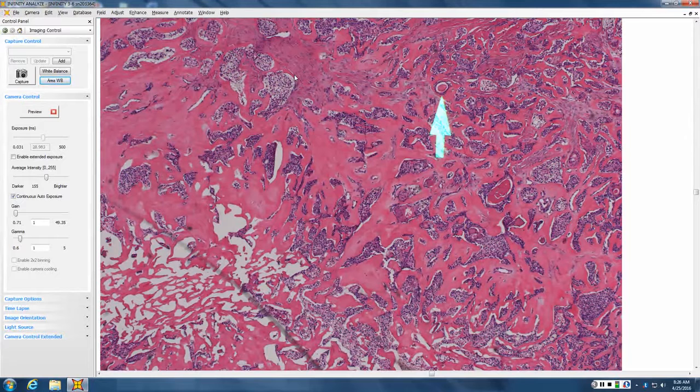That tumor has lots of names: acrospiroma, clear cell hidradenoma, solid and cystic poroma. Anything that's a hidradenoma, a poroma, or an acrospiroma, they're all in the same family. What they have in common is they tend to do clear cell change. They tend to be sweaty, so they have ducts filled with sweat. And they have this osteoid-like stroma that is so characteristic, it's often called poroma stroma. So recognize that poroma stroma because it's a big gift.